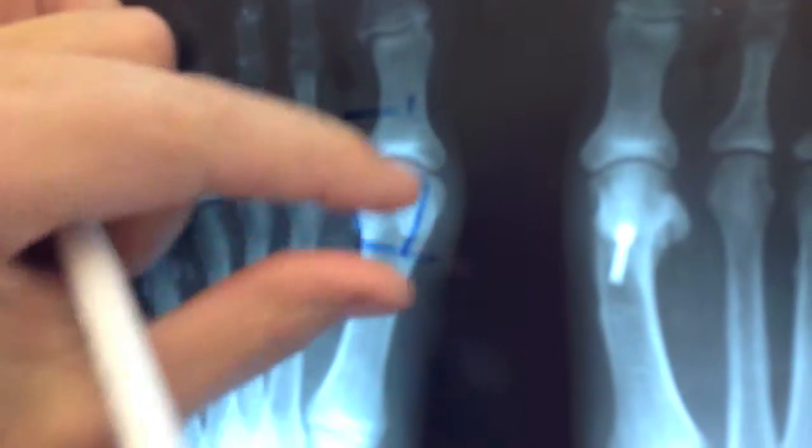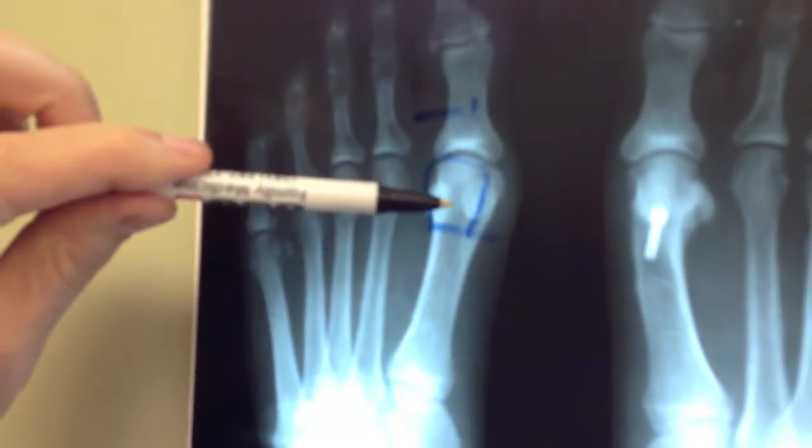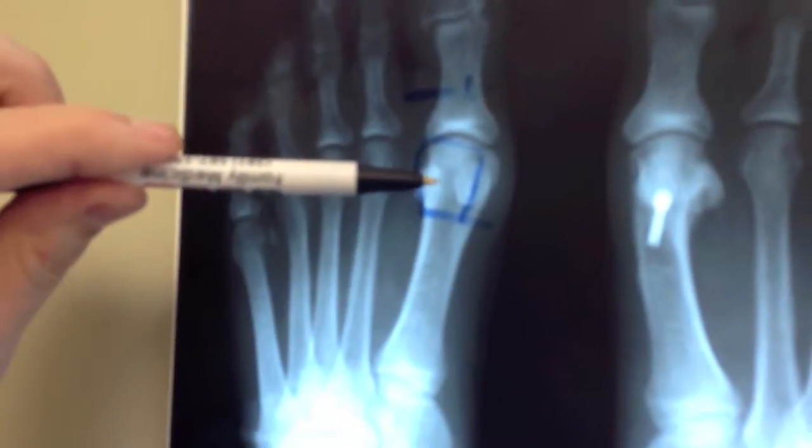We're going to take the head, make the bone cut here, and actually slide the head over. The fixation will be from here to here like the screw, but we'll be using a bone allograft by Solana.